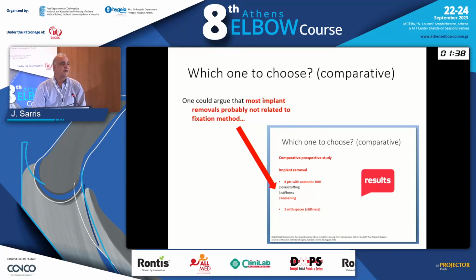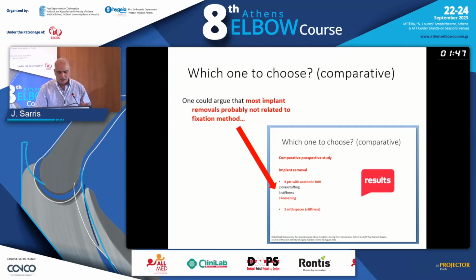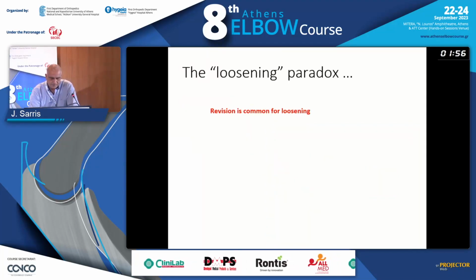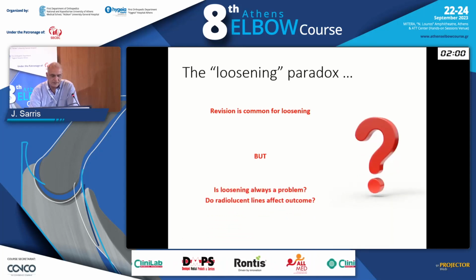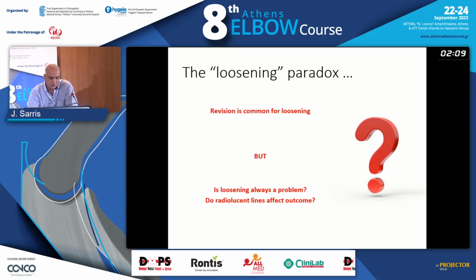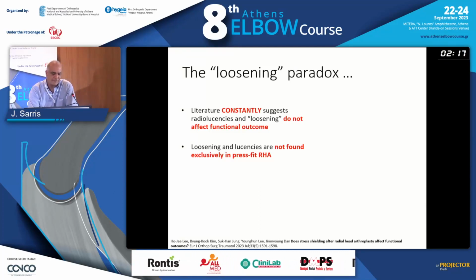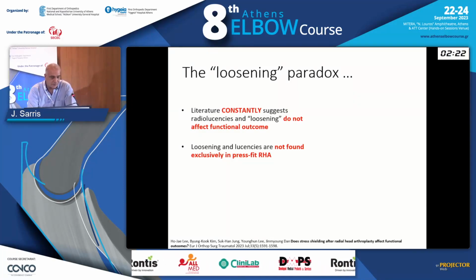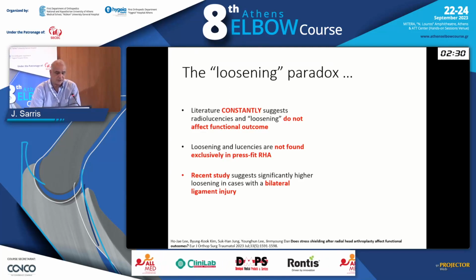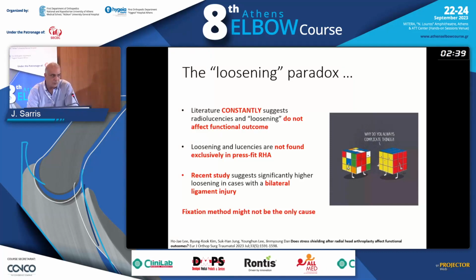Now, if we look closer at the 8 failures of the fixed prosthesis, we'll see that 5 of them were not because of loosening. They were because of a wrong decision by the surgeon, and maybe the trauma pattern that gave the stiffness. So there is the loosening paradox. Revision is common for loosening, but is loosening always a problem? Is the pain from the loosening? Do radiolucent lines affect outcome? Literature constantly suggests radiolucencies and loosening do not affect functional outcome, and they're not only found in press fit, as we said. Now, this recent study in 2023 suggests significantly higher loosening in cases with a bilateral ligamentous injury. So the trauma pattern must play a major role in painful loosening, or loosening with pain.